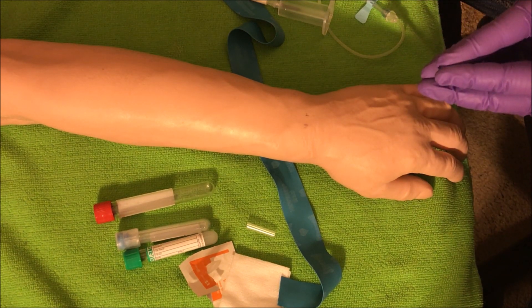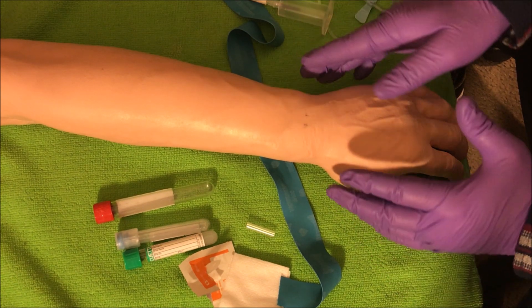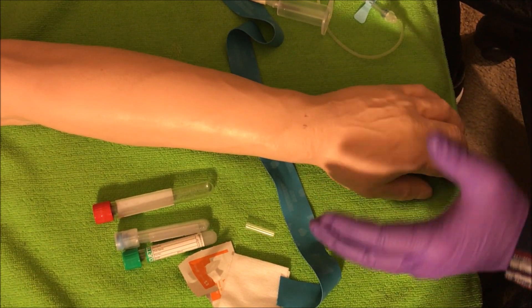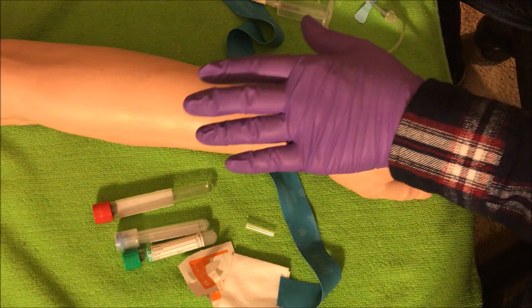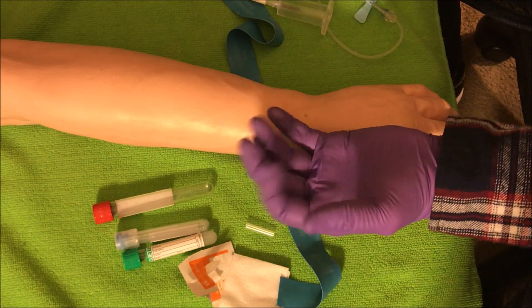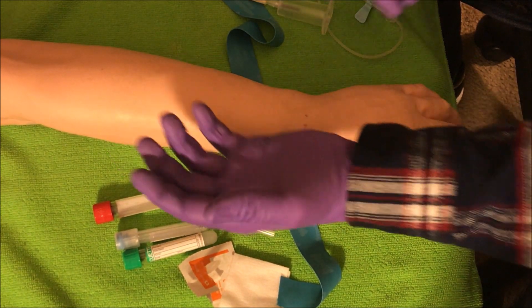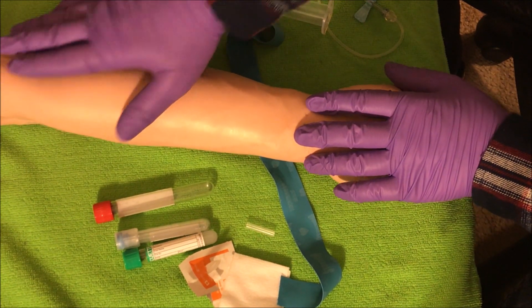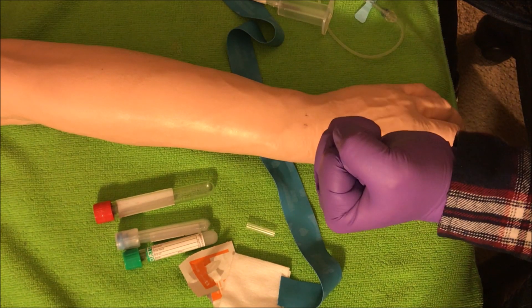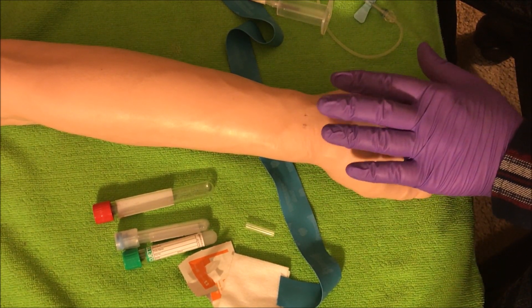Welcome back to Phlebotomy Solutions. I want to make a comment I didn't make in my last video on the straight needle draw. Patients used to pump their fists, thinking it would help get their veins up — either at the break of the elbow where the three veins are. But there's no more pumping of the fist. Do not allow your patient to pump their fist.